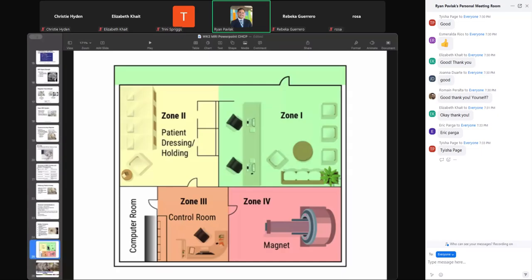So at Akron Children's, where I work, we have 7,500 individuals. We have 12 up at main campus and 4 at our secondary hospital. So what do we got? We got 16 people that have access to zone 4. A little higher number have access to zone 3, but in an organization of 7,500 people, only 16 people can get into this room. Like I said, it is the most restricted room in a hospital.